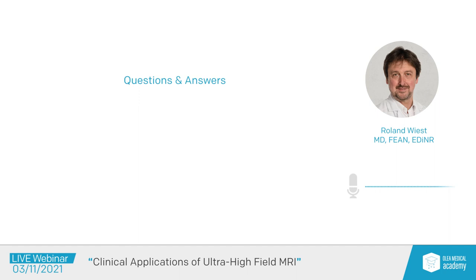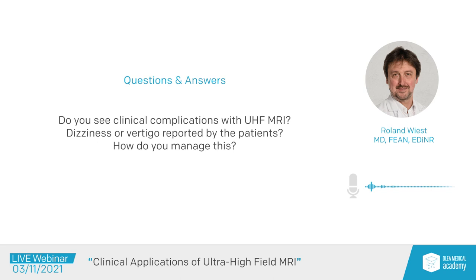So definitely the patients complain about vertigo. Almost all of them have this sensation once they enter the scanner and once they are taken out. I think one of the principal advantages is that the new system has not a manual table anymore. It has an automated table. This allows to bring the patient very carefully into the scanner. And we really did not have any dropout related to vertigo up to now, because the patients are informed about this situation, that they may experience dizziness, and they tolerate it very well. So we really didn't have any dropouts.